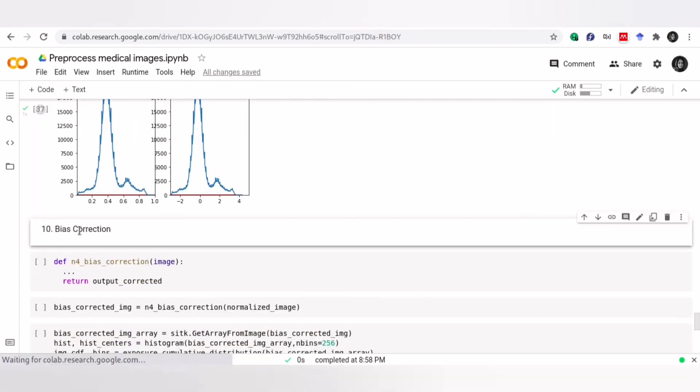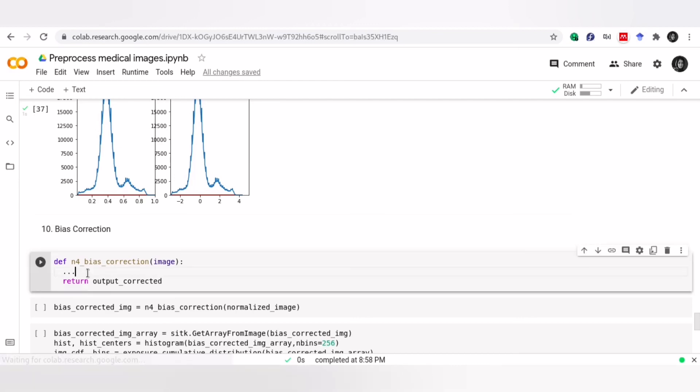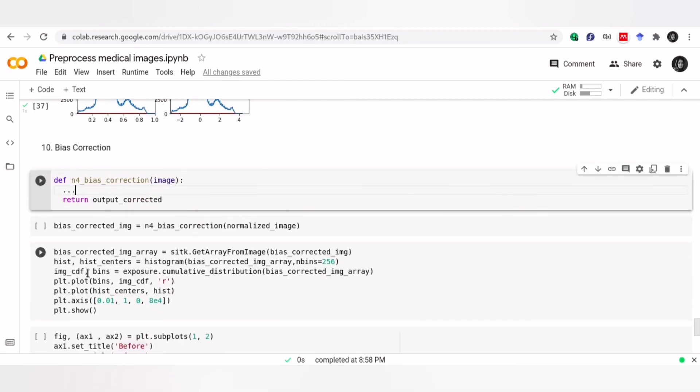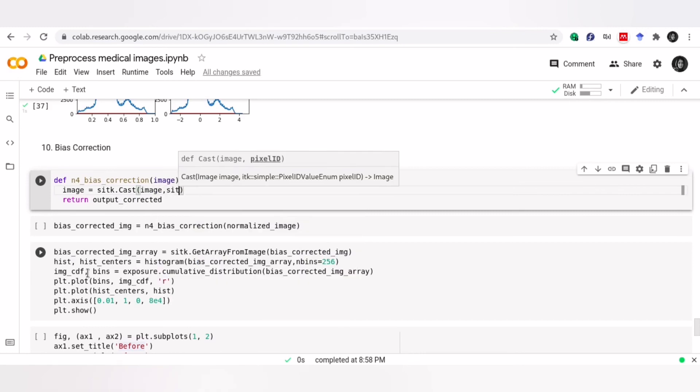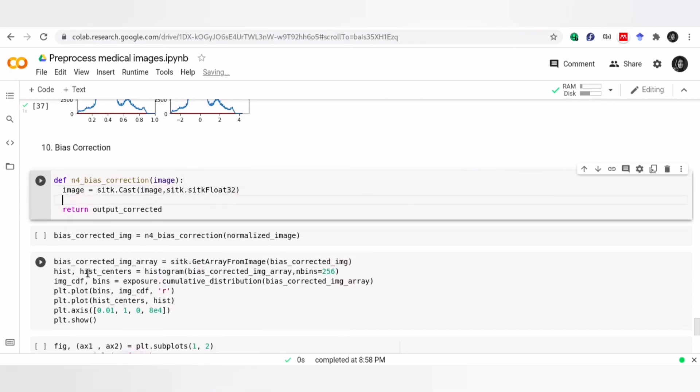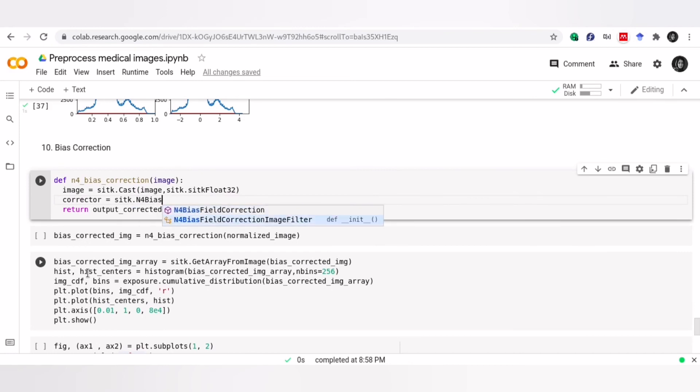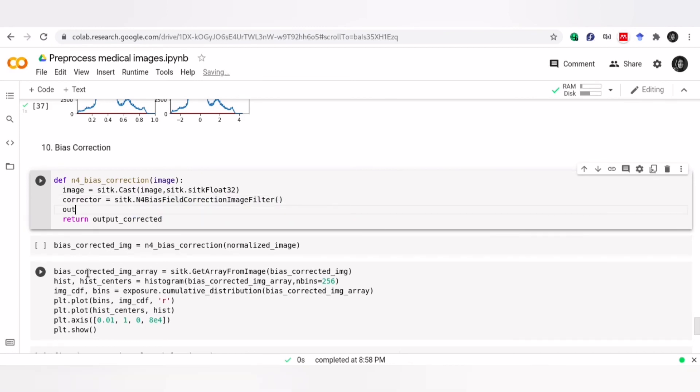Now let's talk about bias field correction. Bias field signal is a low frequency and very smooth signal that corrupts MRI image, especially those produced by old MRI machines. The N4 bias field correction algorithm is a very popular method for correcting this signal. In order to use this algorithm, we employ SimpleITK library. Here, the primary input is required to have a type of either SITK float 32 or SITK float 64, so we need to change the type. Then we should define our filter and apply it using execute function.